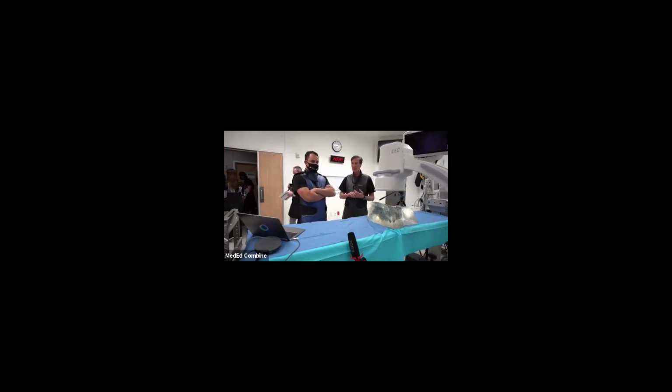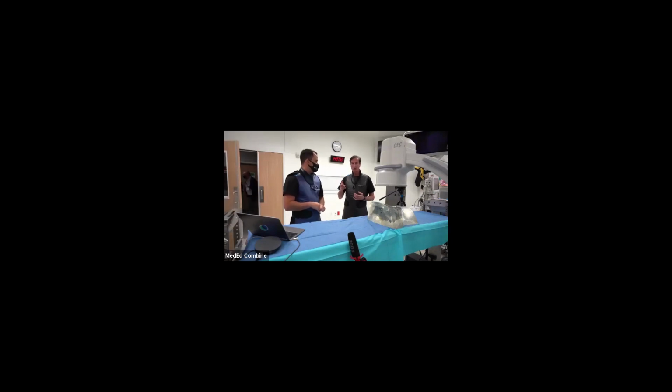To me, you need the three things I talked about: 6 months of chronic back pain, 6 months of failed conservative therapy, and Modic changes on MRI. Exactly. Based on the INTRACEPT and SMART trials, it's done by visualizing the degenerative end-plate changes at levels L3 through S1. So you don't have to test for it, but I do. It gives an added benefit and a chance to improve from a simple disc injection.